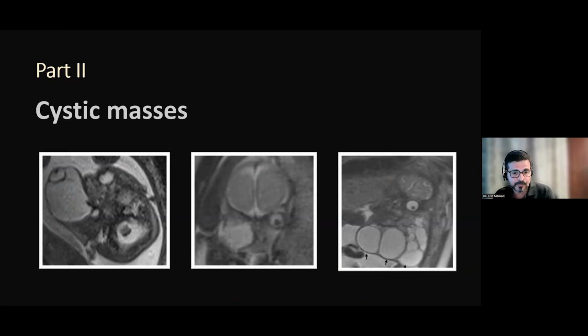This is a problem area because you can give a list of differentials and one of those is going to be true. These are three different cases out here, standard static images. One of them is definitely going to be true. You're going to call this either a lymphatic malformation, or you have to be worried about a teratomatous growth, or depending on the location, you call it a dacryocystocele. But remember, that whatever you say has big implications at the end of that process.